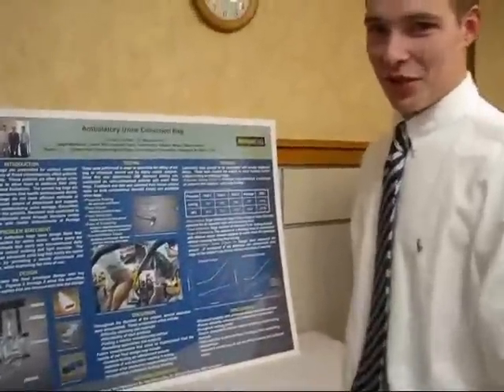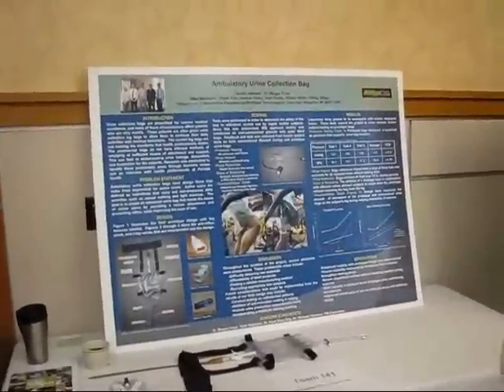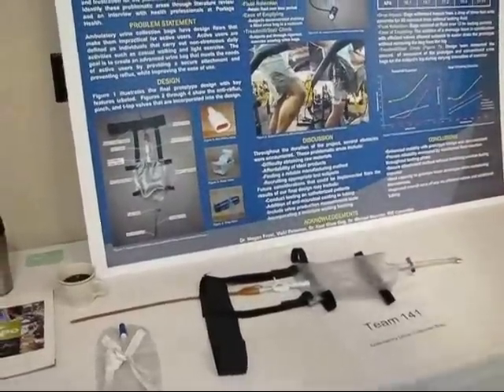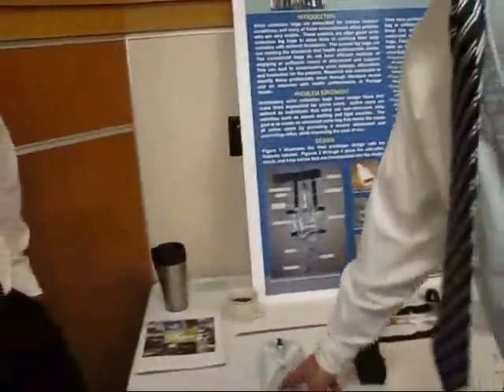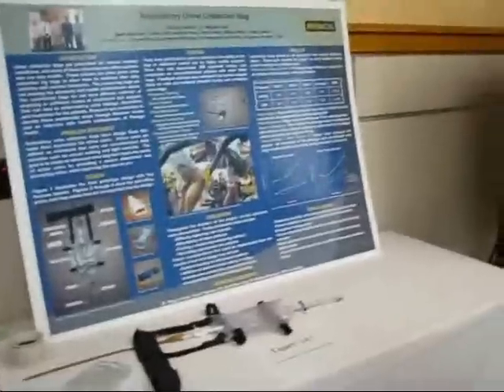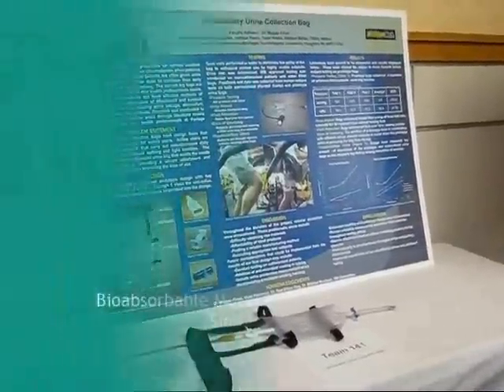This is the Ambulatory Urine Collection Bank. We're team number five, and this is the project we came up with. It is designed for more active users. This is the urine bag that they currently use at the hospital, and we renovated it to make it more compatible for people who are more active.